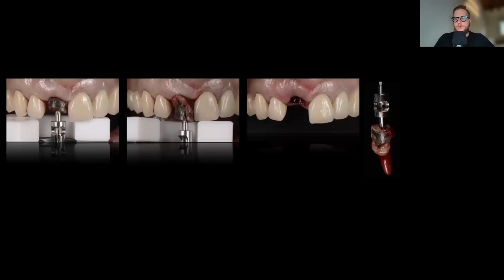So the first thing we do, as I said, is we're going to go ahead and do the extraction. It's very important to be as minimally invasive as you can. In my mind, there is no such thing as an atraumatic extraction, because every type of extraction is going to be some trauma. We're removing a root. So we want to be as minimally invasive, or as minimal trauma, as possible. And we like to use this instrument. It's called the Benex extraction system.